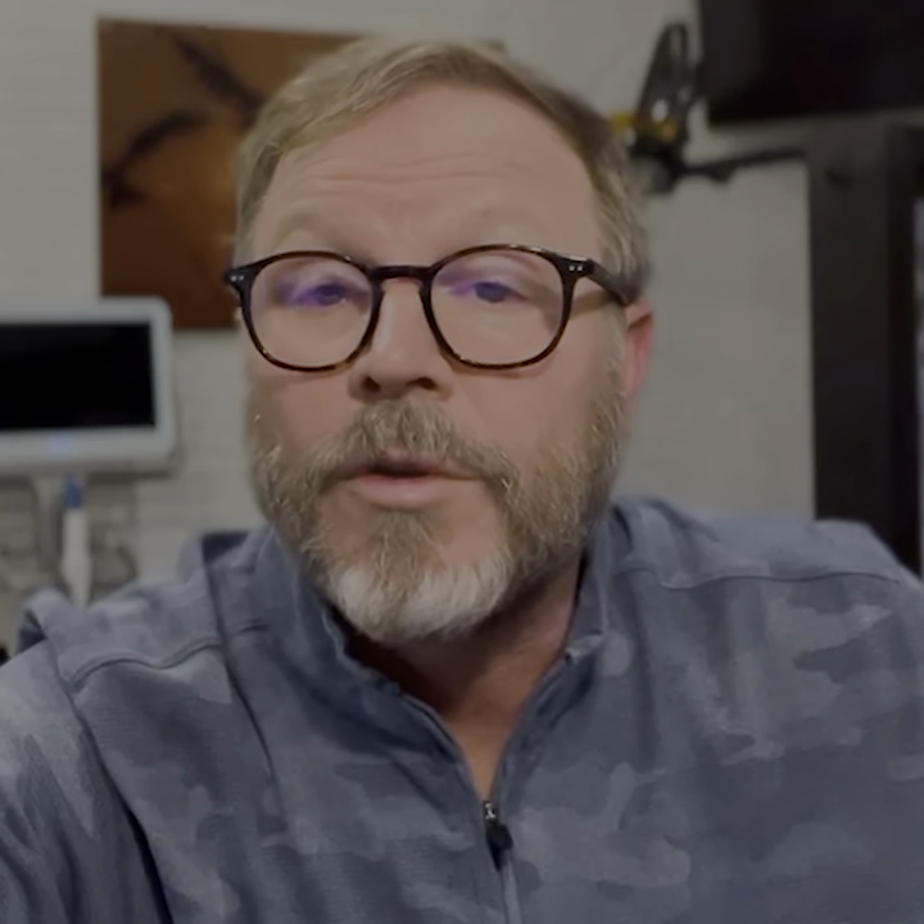It has changed the stress level when it comes to permanent retainers. Assistants will scan, get the wire prepared, and then I just come and I bond it.